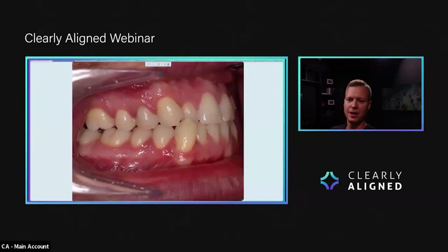If he was just biting like he's got that slight class 3 on the molar that we see, if he was biting in perfect class 1 on both sides, we'd be less worried about him finishing with an edge-to-edge bite. But the reason why we end up, in many cases, with the posterior open bite has to do with the way that the occlusion's hitting, right?